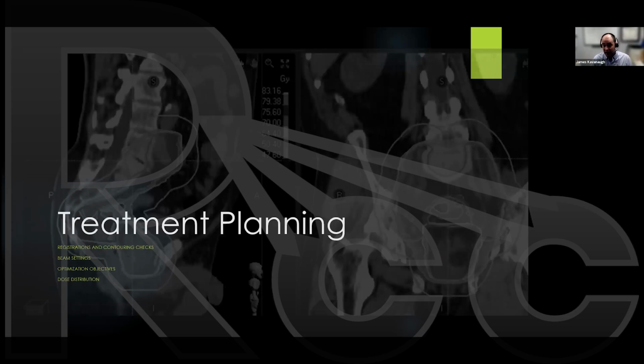So as best you can, if it is important, having some guidelines set up. And by important, thinking about, is it SBRT? Is it high dose in a small number of fractions, in which every fraction becomes really critical?